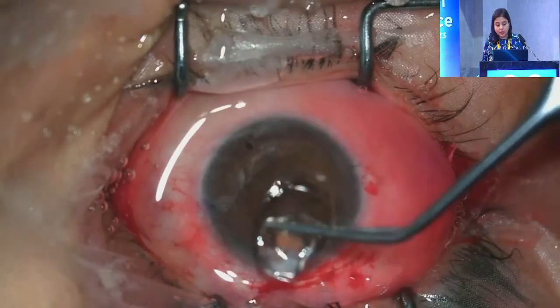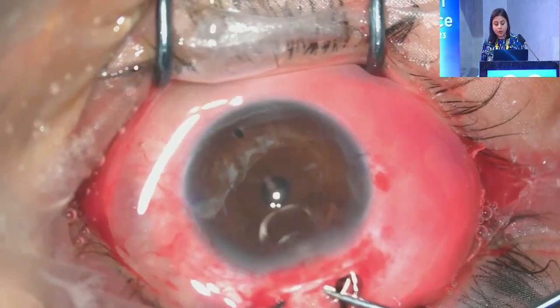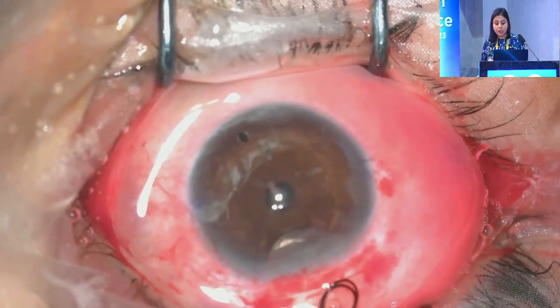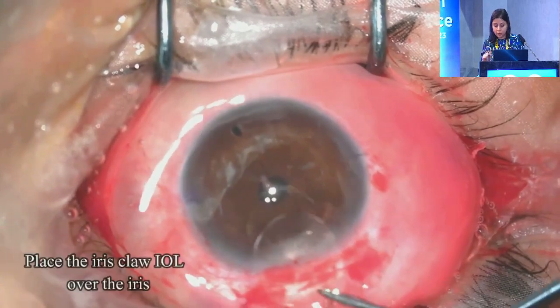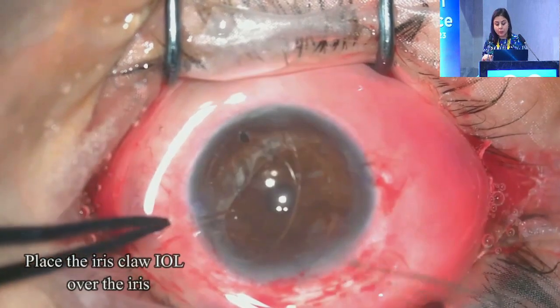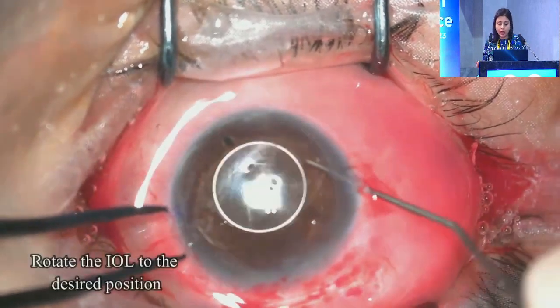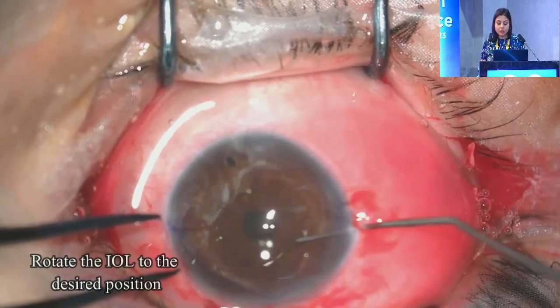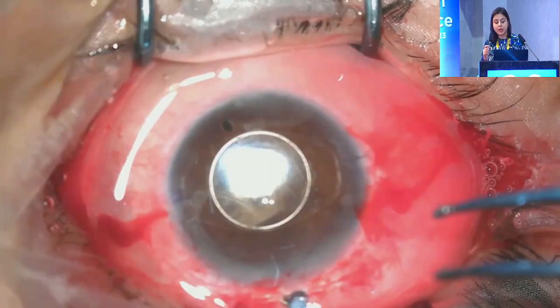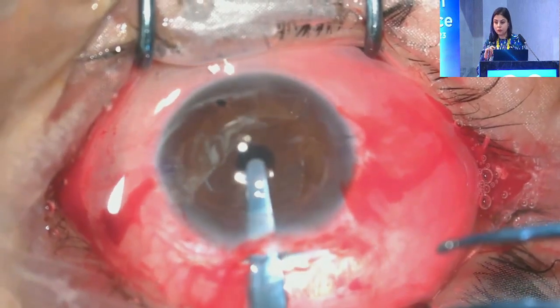And then we enter the anterior chamber, and we first place this IOL on top of the iris. We can easily put this IOL inside with a 5.5 millimeter incision. Once we have placed this IOL on top of the iris, we can use a dumbbell dialer and rotate this IOL into position. These marks help guide us as to where exactly the claws need to be, and what position of the lens we should keep it in.